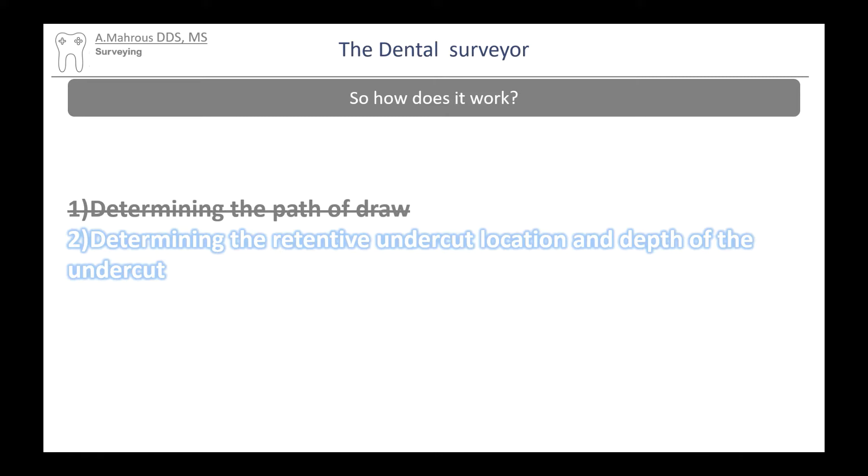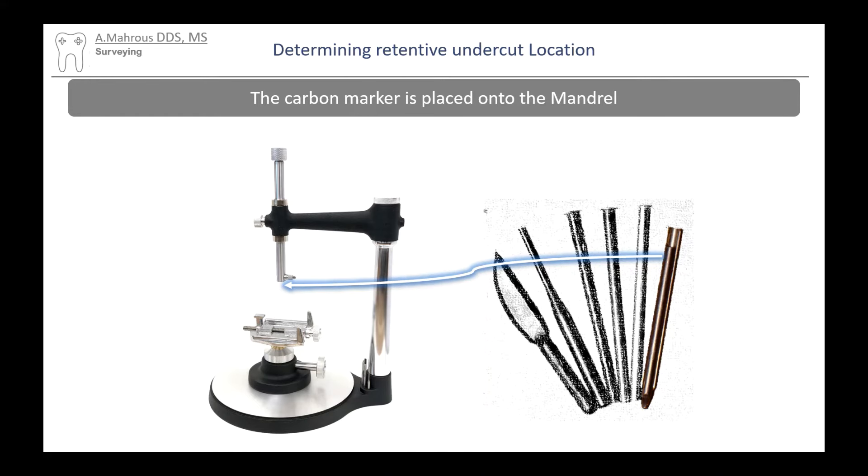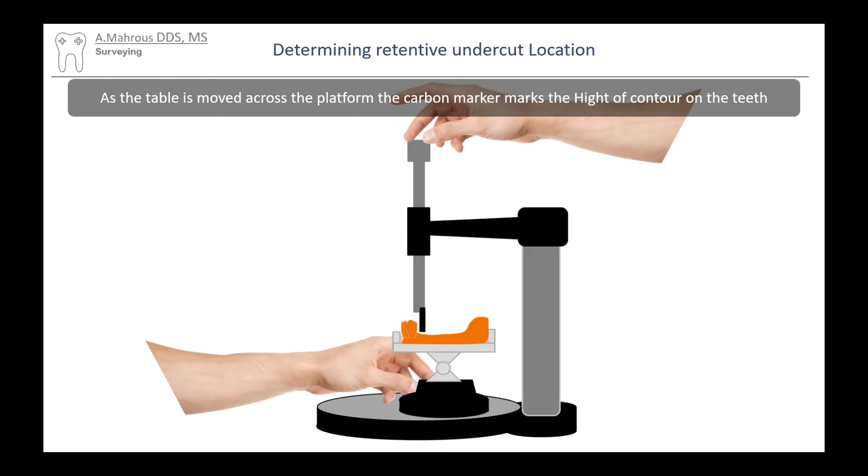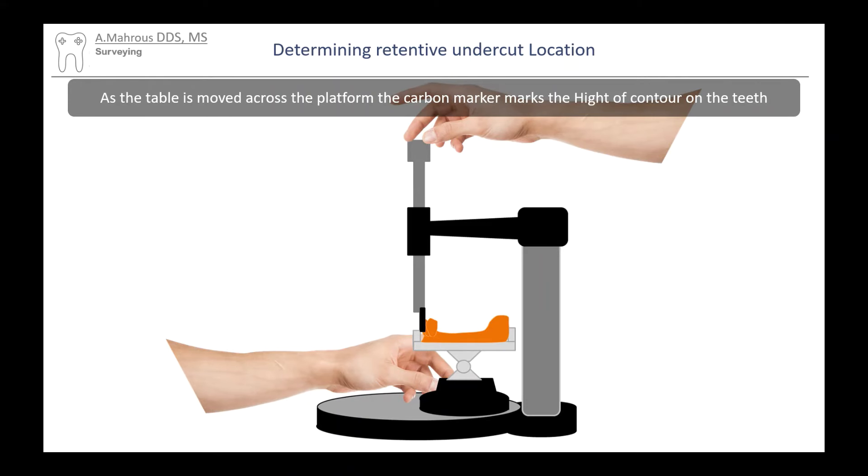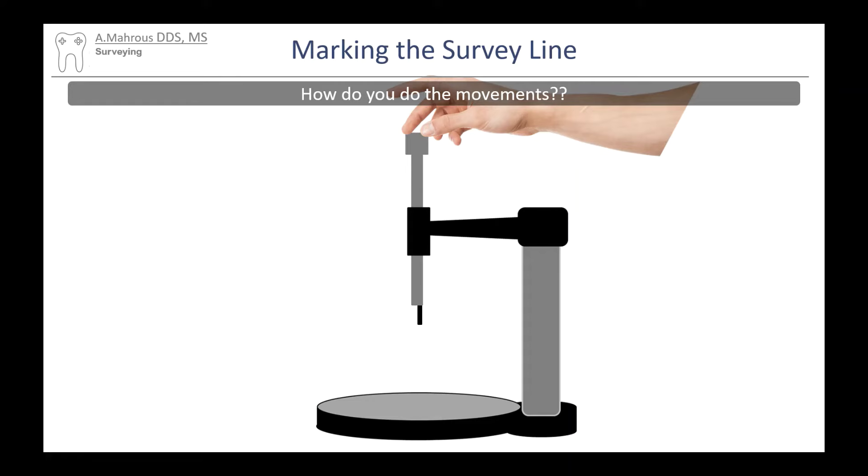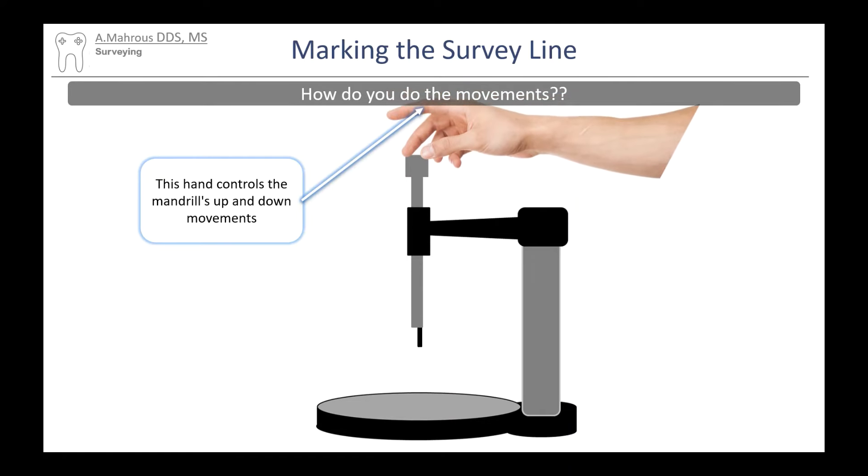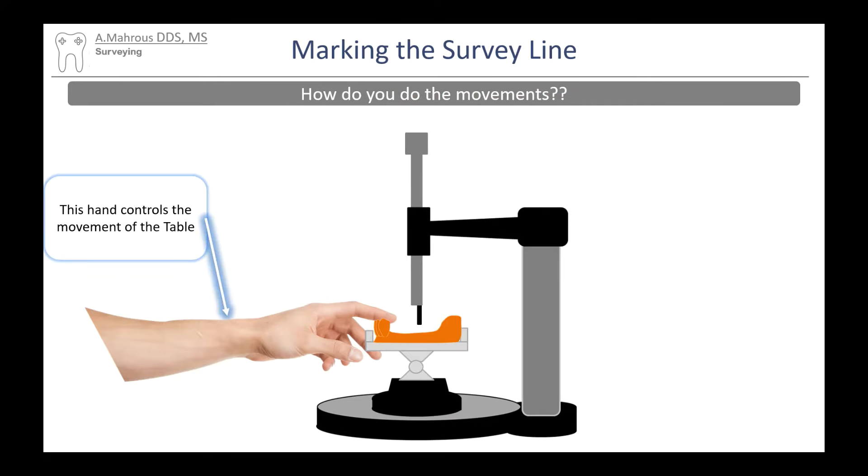So we're done with determining the path of draw. Now let's move on to determining the retentive undercut location and depth of the undercut. For this we'll go ahead and use the lead marker and the metal shield. We'll place those on the mandrel and we'll go ahead and go through the process of what we call drawing the survey line. To do that, we're going to use both our hands to move the table across that platform and at the same time we're going to be moving that mandrel up and down to coincide with the tooth contours.